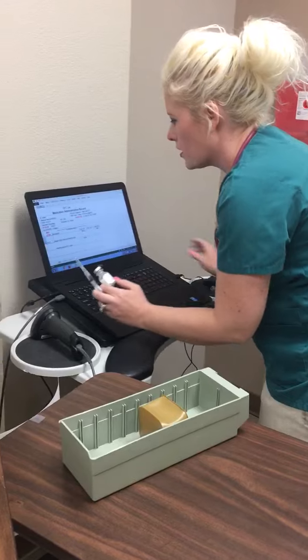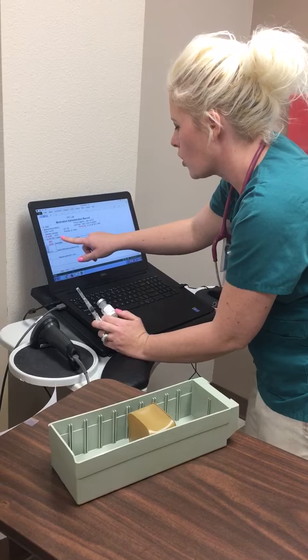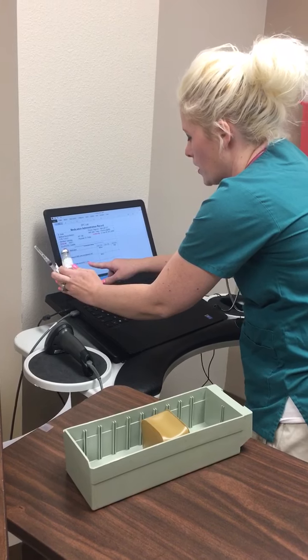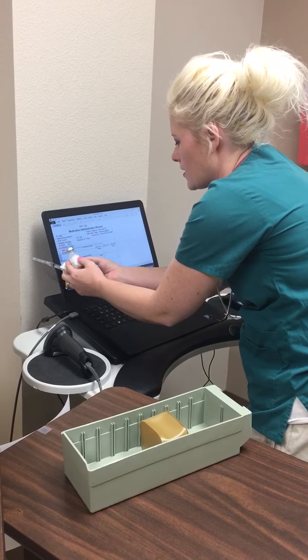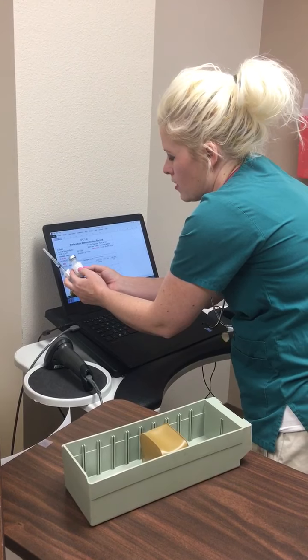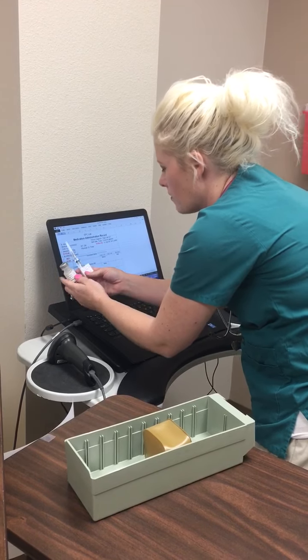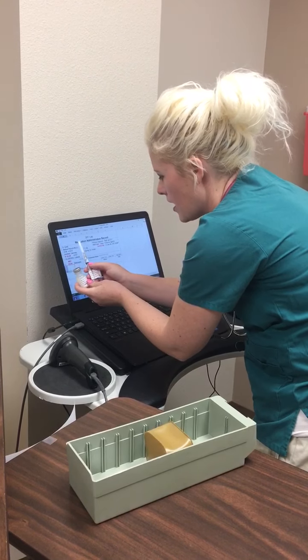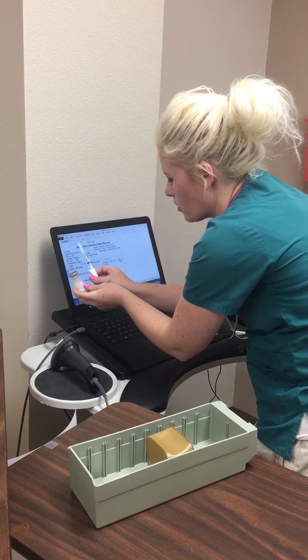My next medication we're going to do our check. B. Smith, date of birth 4/24/57, allergic to codeine. I'm going to be giving influenza vaccine, IM, ×1 now. I'm giving the 9 a.m. dose. I have influenza virus vaccine, lot number 107057, expires 10/30/20. Dosage 0.5 mils equals 1 adult dose. I have prepared in my vial influenza vaccine 0.5 milliliters. I see I have 0.5 milliliters in my syringe, and I have my label completely filled out.